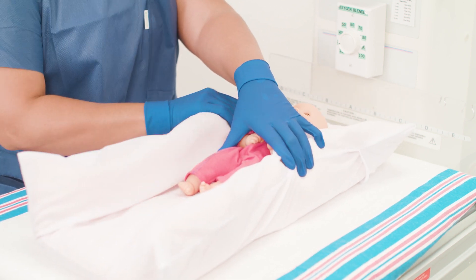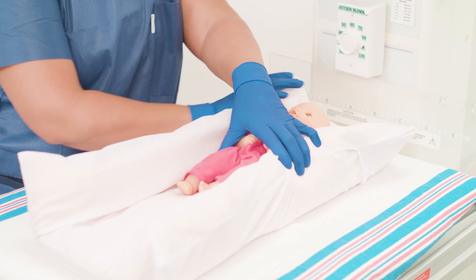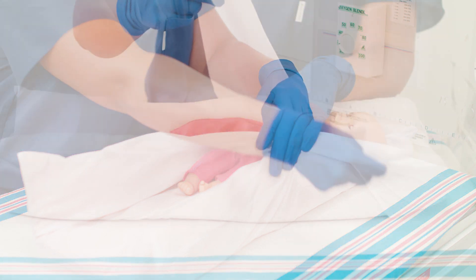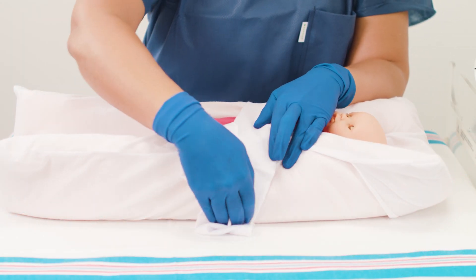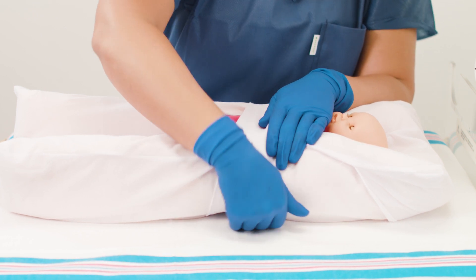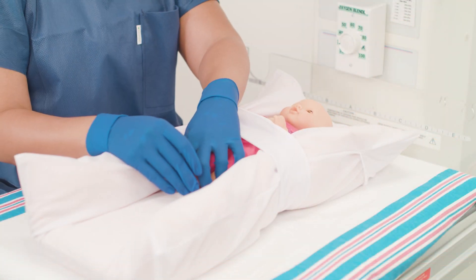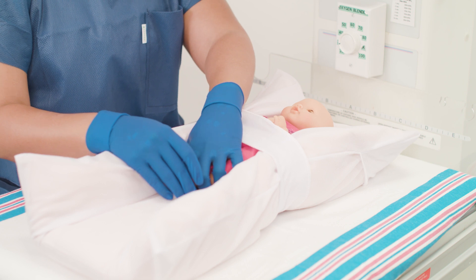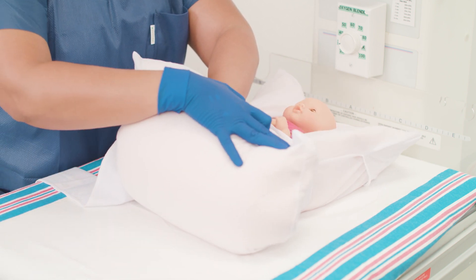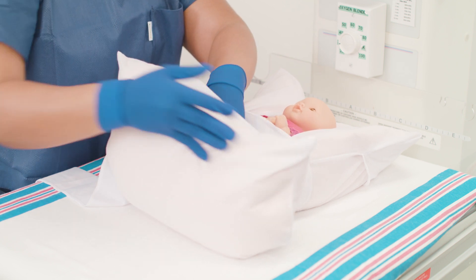Bring the strap closest to the chest up and across the cradle that you've created. Wrap it around and tuck under the positioner to secure. The straps will help the positioner hold its contained shape in the incubator. Use your hand to cup the baby's feet and mold the bottom of the positioner up to encase the leg. Making a small crease at the molding point will make it easier to create a boundary with the positioner.